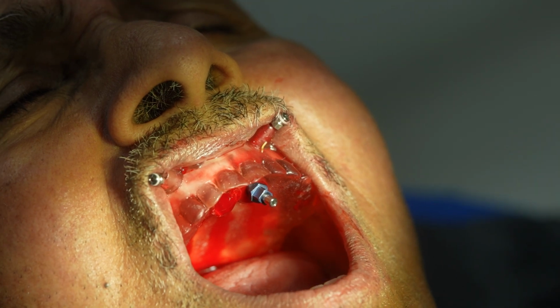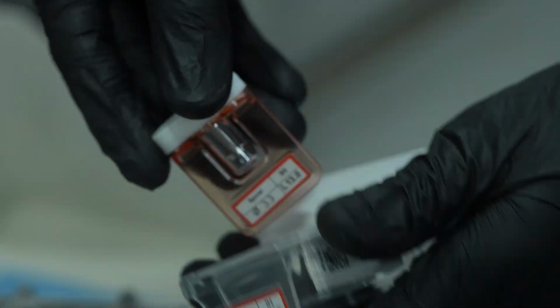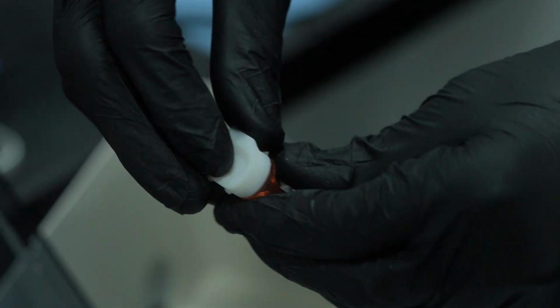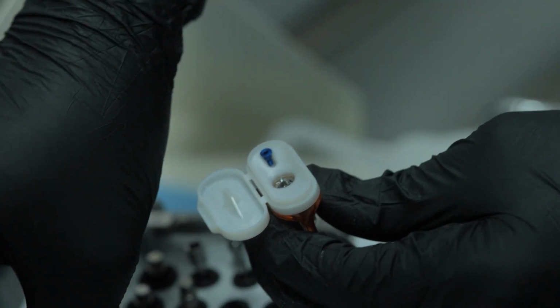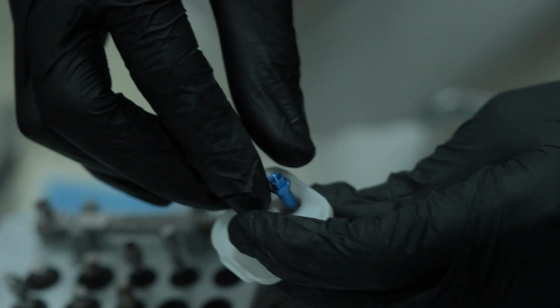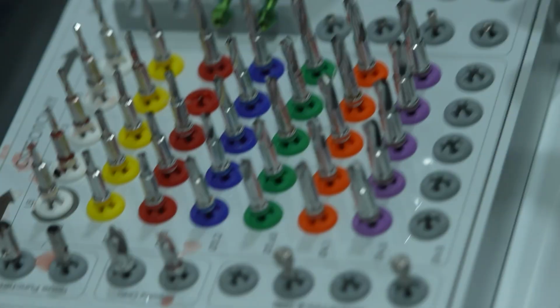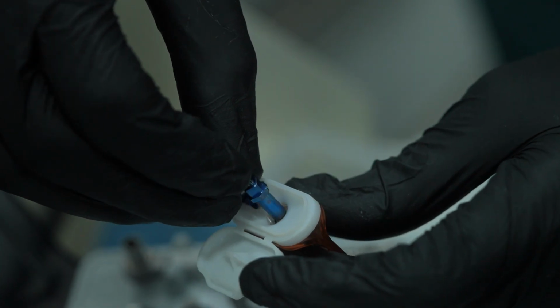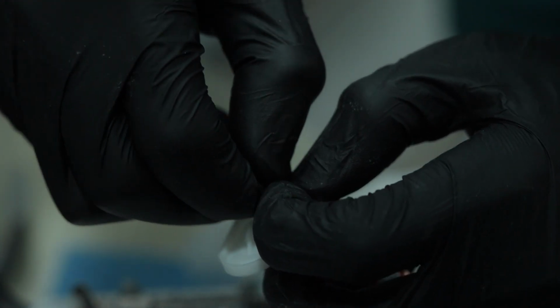Now we will do the second one. So we are opening the second implant. Now I will just show it to you how you need to attach your implant over here. There is a small blue adapter which goes and engages over there. Then we need to tighten it with the screws. There are long screws which are available. So these are the small screws which we will just tighten. There is a separate driver for it.